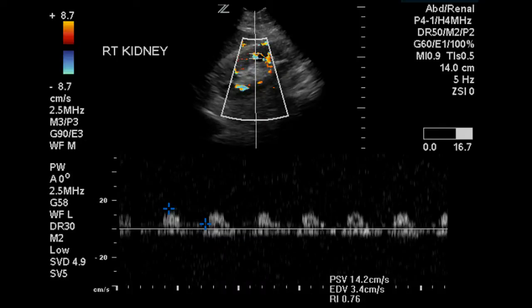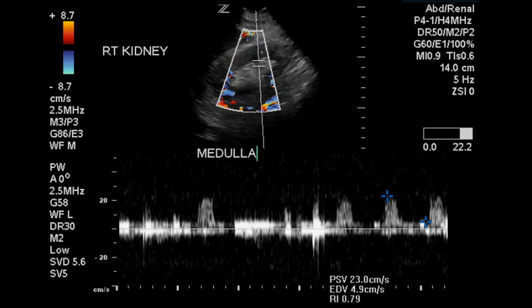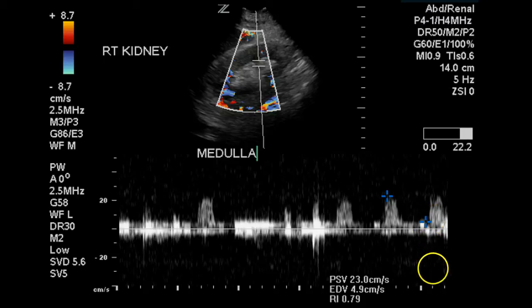This is a Doppler signal from an arcuate artery, and the resistive index is above 0.7. This is a low quality waveform. This is an image and Doppler signal from one of the lobar arteries. The diastolic flow is better demonstrated in this artery, and we have a resistance that is approaching 0.8 — it is 0.79. This is at the upper limits of normal.